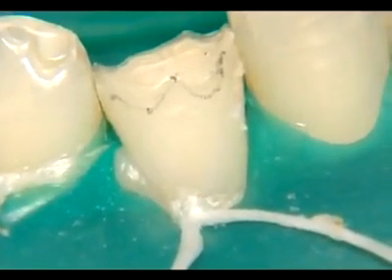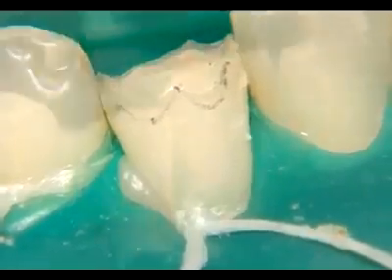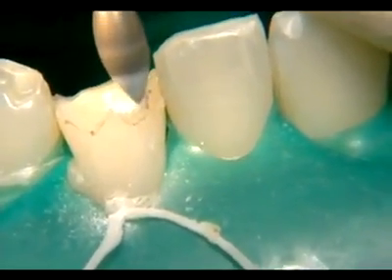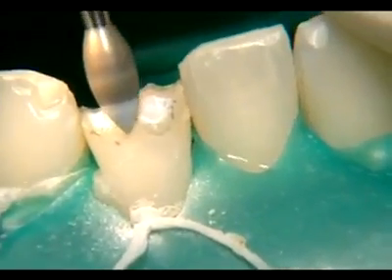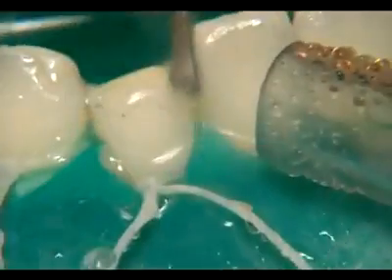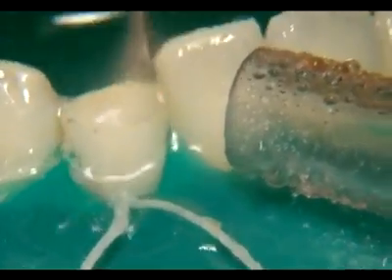After a rubber dam has been applied, the vestibular preparation margin is marked with a wave-like line. A bevel is prepared, using light pressure and low speed. Water spray is not used. A conventional bevel is prepared along the lingual aspect of the incisor. It is advisable to use oscillating instruments for interproximal preparation.